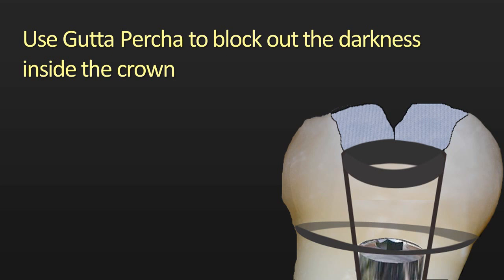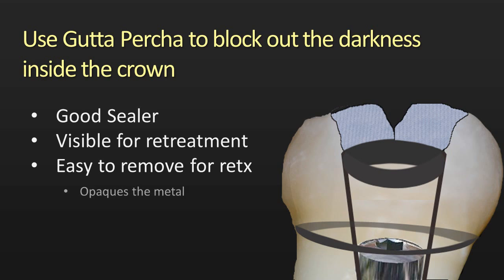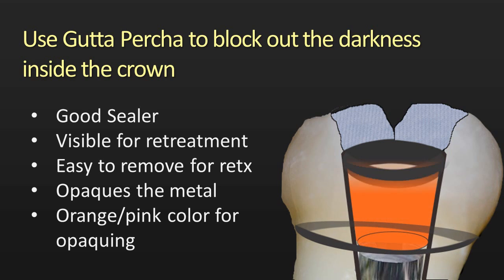The first thing I'm going to use to block out that darkness inside the crown is gutta percha. I like using gutta percha for several reasons: it's a good sealer as we know from root canal treatments; it's highly visible for re-treatment, so it's easy to see when I'm getting through the composite into the gutta percha; it's very easy to remove for re-treatment; but most importantly, it's going to opaque out the metal and raise the value in the internal aspect of the crown. I like the orangey-pink color of this gutta percha because it makes it easier to opaque and block out that low value.